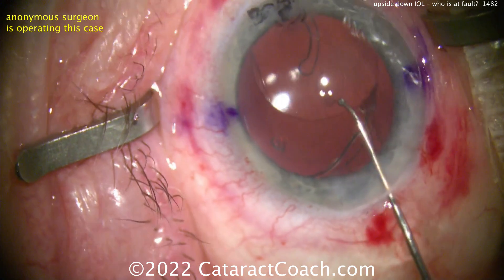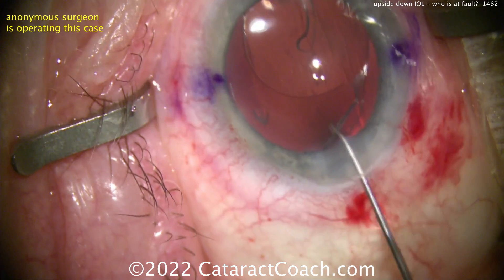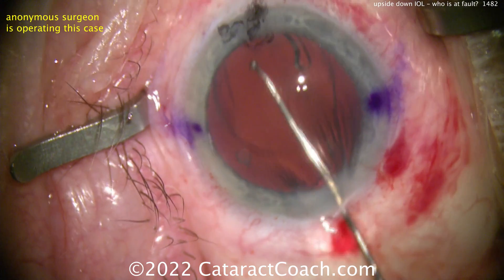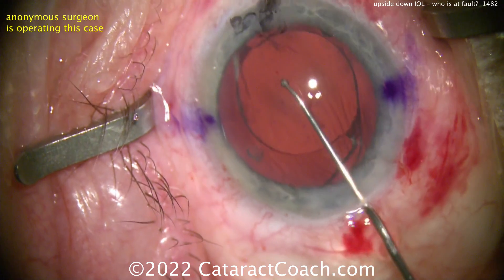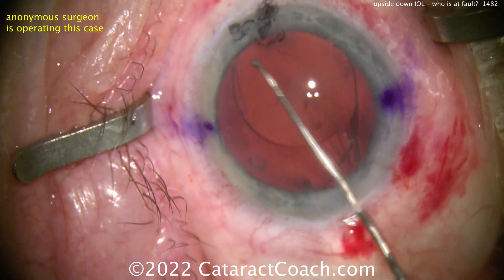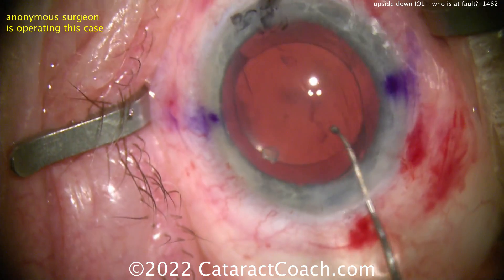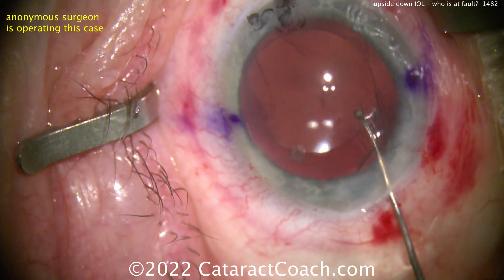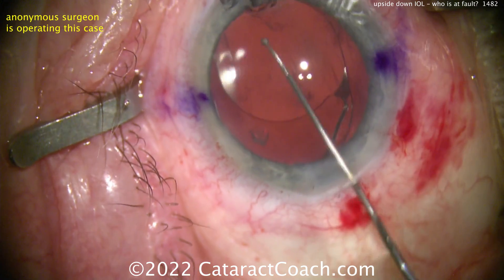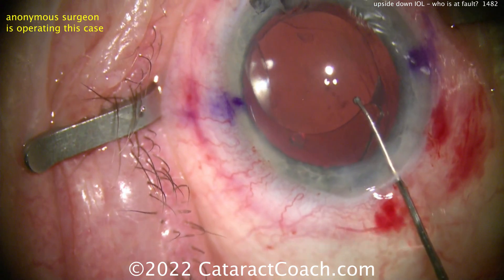The surgeon had to make a quick decision as to which way to flip the lens. The decision was to go in one direction, but it needed to go the other way. Now the lens is sitting in the eye, definitely upside down.